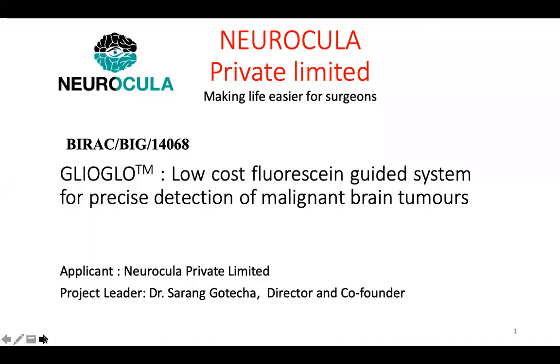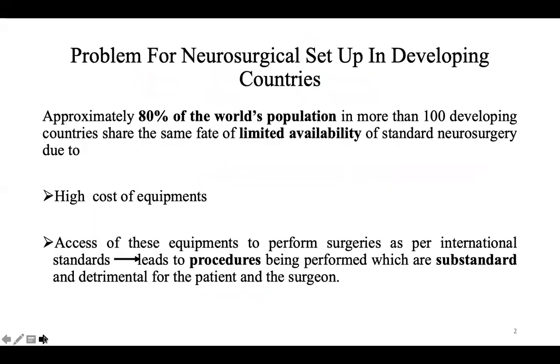Hello everyone, this is Dr. Sarang Gotecha and I will be presenting about my device Glioglo, which is a low-cost fluorescein guided system for precise detection of malignant brain tumors.